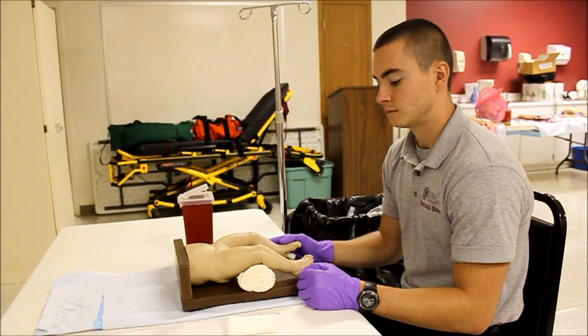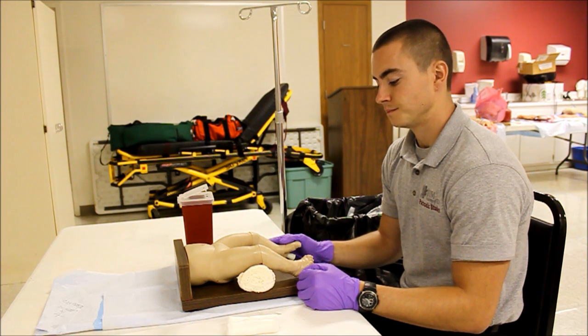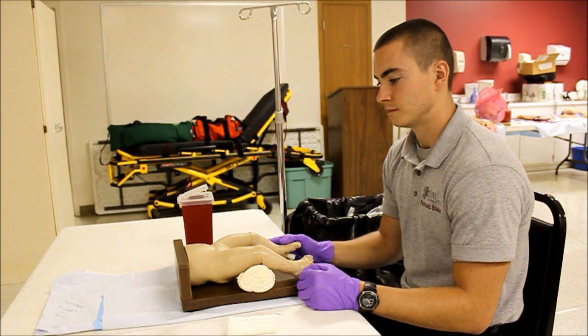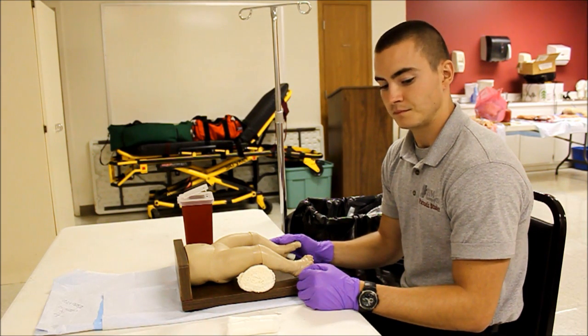This is your National Registry Advanced Level Psycho-Motor Examination, Pediatric Intraosseous Infusion. You have before you a 22-pound baby that requires a fluid bolus. You have been unable to obtain IV access.